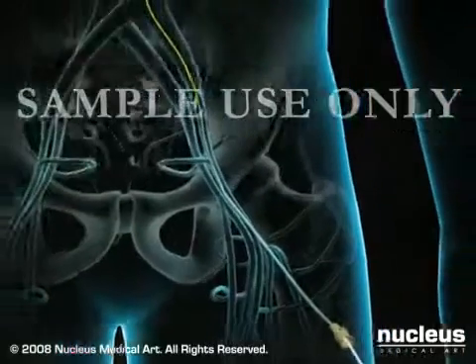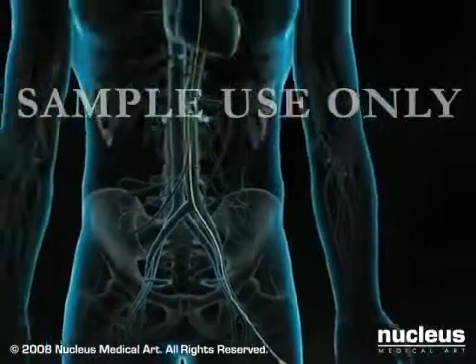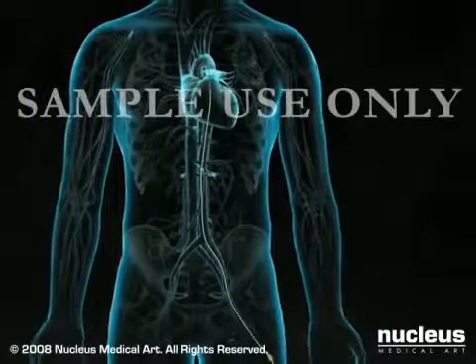The procedure is monitored using a continuous x-ray imaging device called a fluoroscope. You may feel pressure as the wire and sheath are inserted through the groin and pushed through the artery.